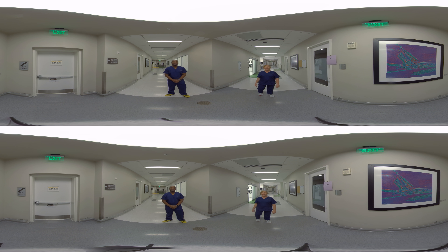Hi everyone, thanks for joining us today. My name is Emily and this is a virtual reality 360 experience for the Arctic Sun STAT temperature management system. Today we're going to show you how to deliver targeted temperature management therapy for neonatal and pediatric patients.